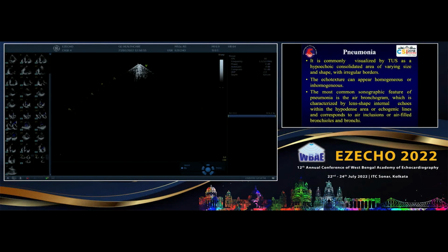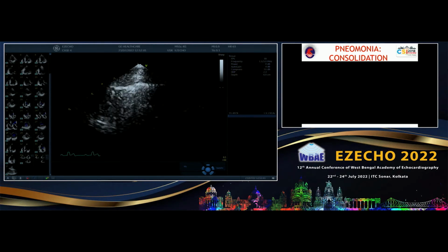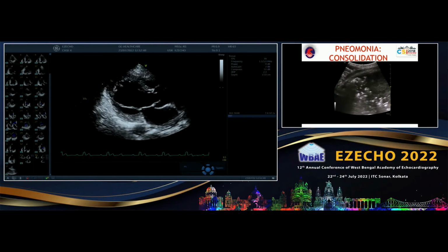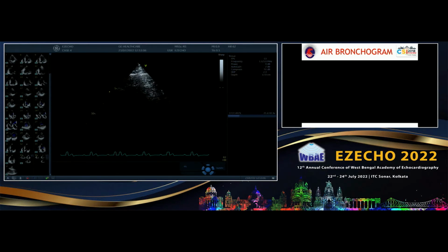Generally, we do the same echo probe. She's doing an echo now. Let's do an echo regularly. Patient is in supine position, and this is the echo, right? Just see there, right? And once I put the same thing on the lung, now put the lung, right? So this, it is darker. So actually, no, just go back. Jaisa tha waisa rakha, right?